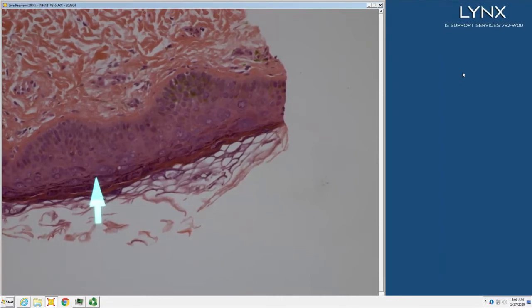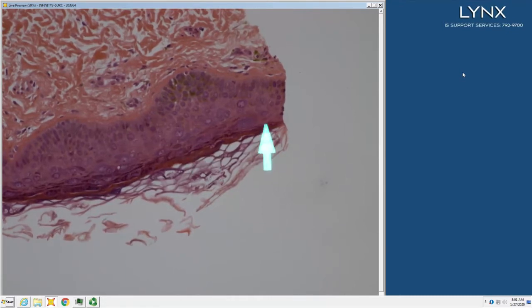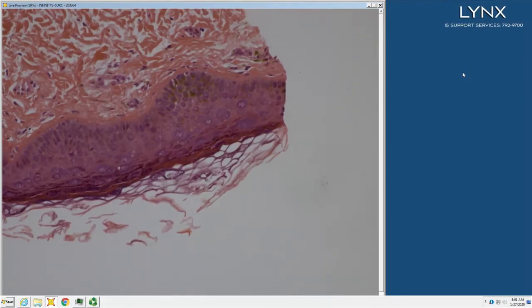Like EDV. So unless they're protected from sun, at what age will this child die? 20s, 30s, if they're lucky. With sun protection, they can live a normal life, but without sun protection, they'll die about the same age someone with xeroderma pigmentosum would die, of metastatic squamous cell carcinoma. So those blue foamy cells, the coarse basket weave, all go with epidermodysplasia verruciformis. Very good.